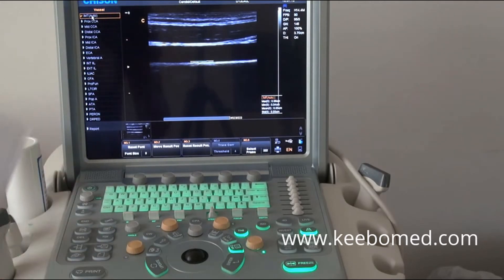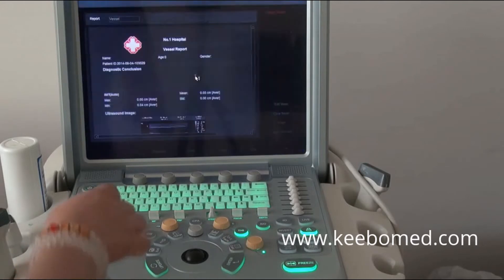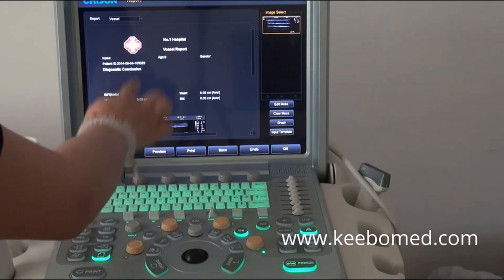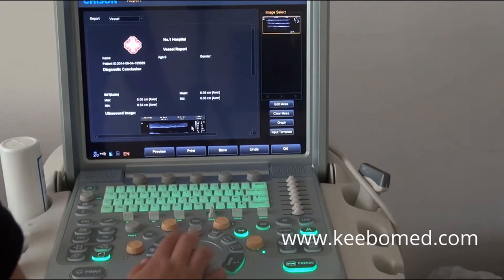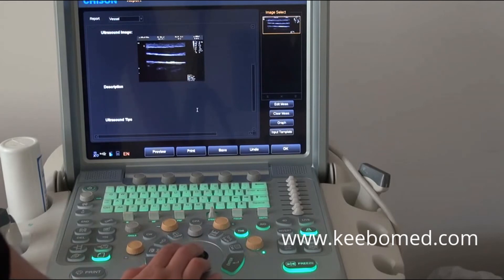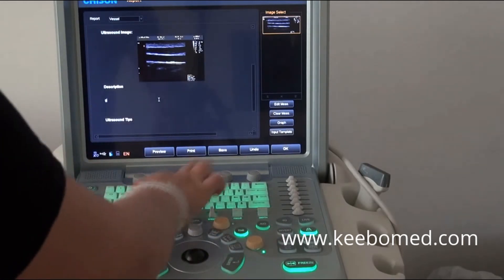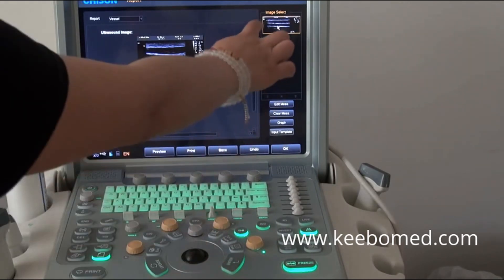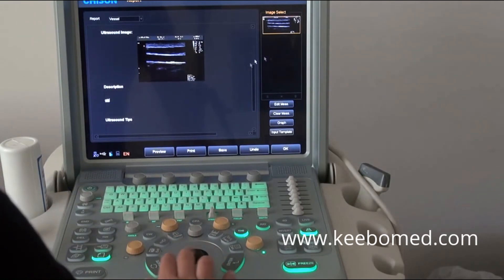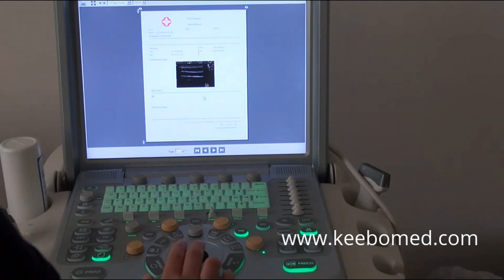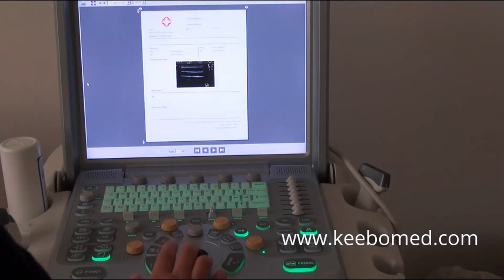After that, press the report key. The system will show the report. We can find the calculation results are also shown on the report. Here we can import a diagnosis conclusion, as well as the images we saved. We can select images and then preview the report on A4 paper to see what it looks like when printed.